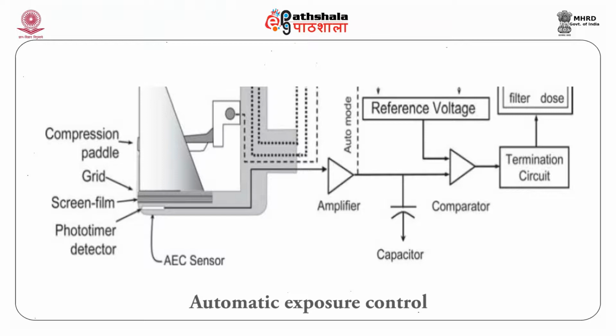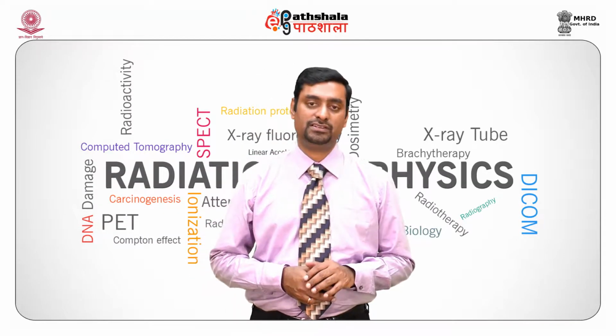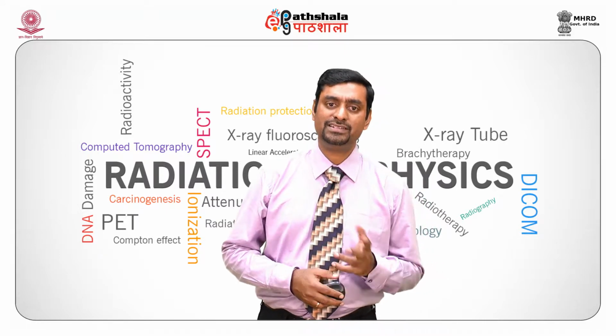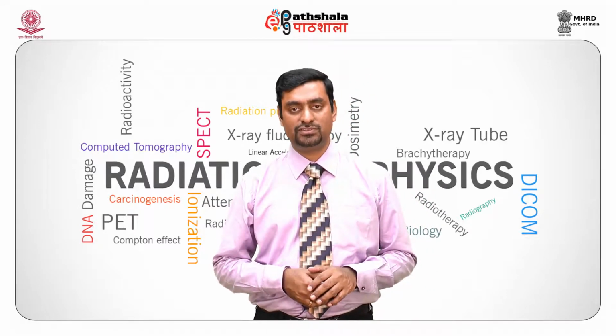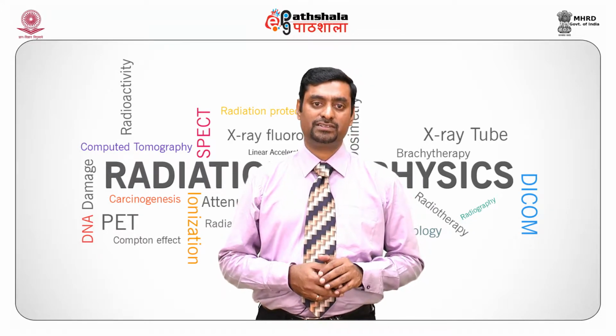It also has the circuit which automatically cuts off the radiation once the predetermined value for creating a good image is reached. The cutting off is done using relays, just as we find in automatic exposure control in a digital radiography system. Let us go on to the image detectors. Traditionally, film screen receptors were used. Later on, we move on to digital detectors.